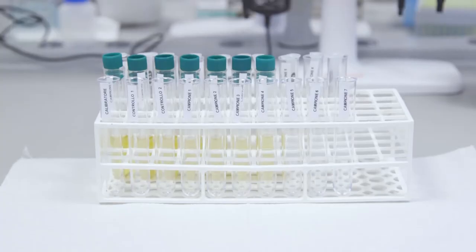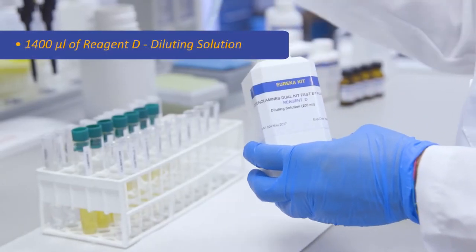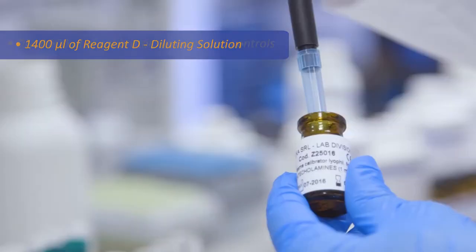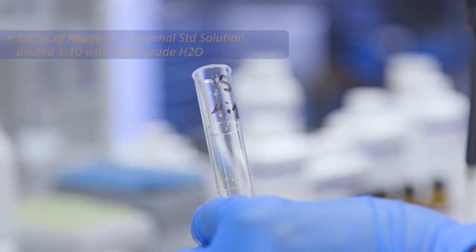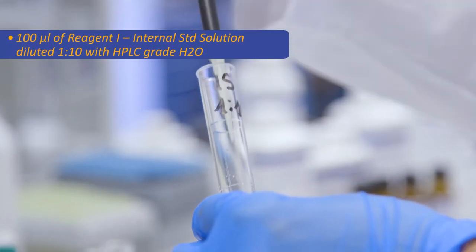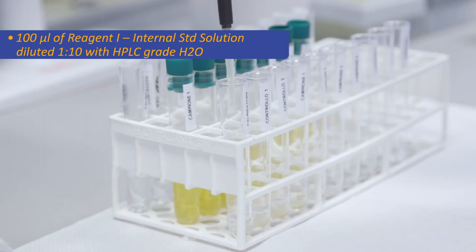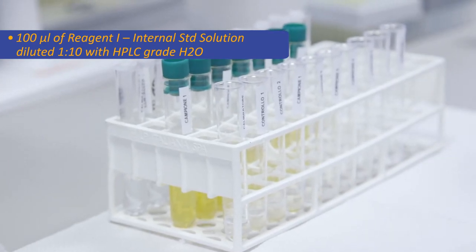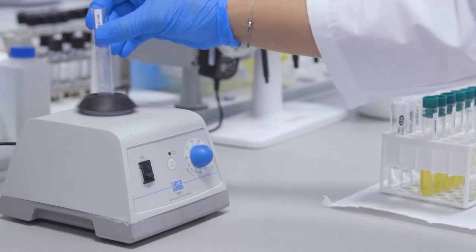Now we dispense in sequence in all the tubes 1400 microliters of reagent D diluting solution, only 600 microliters of calibrator samples and controls, 100 microliters of reagent I internal standard solution diluted 1 to 10 with HPLC grade H2O, then place in a vortex for five seconds.